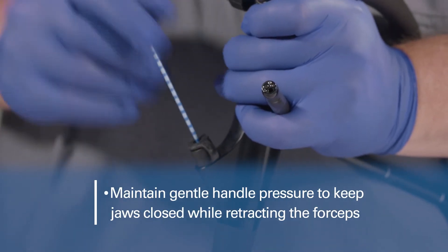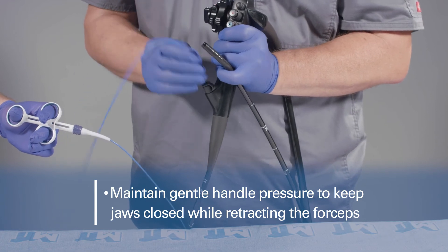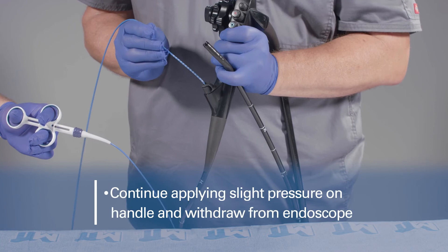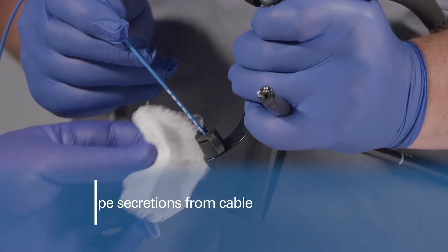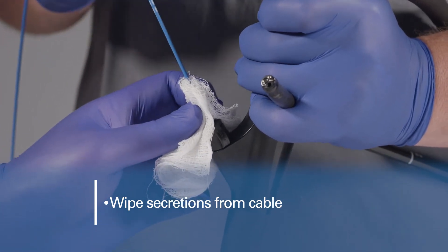Maintain gentle handle pressure to keep the jaws closed while you retract the forceps from the site. Continue to apply slight pressure on the handle and withdraw the forceps from the channel. While withdrawing the forceps from the endoscope, wipe excess secretions from the cable.